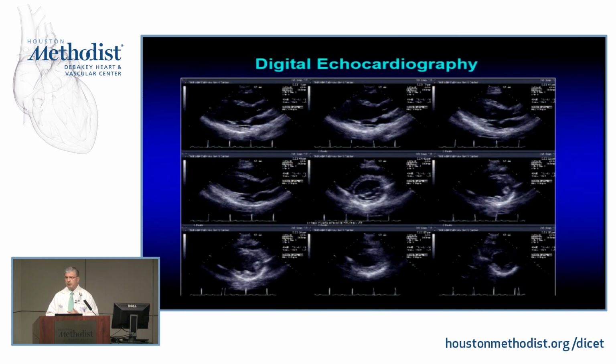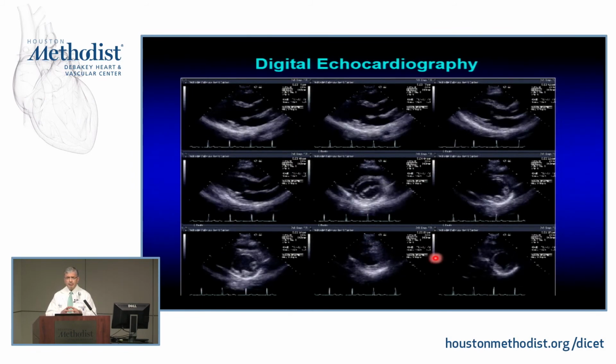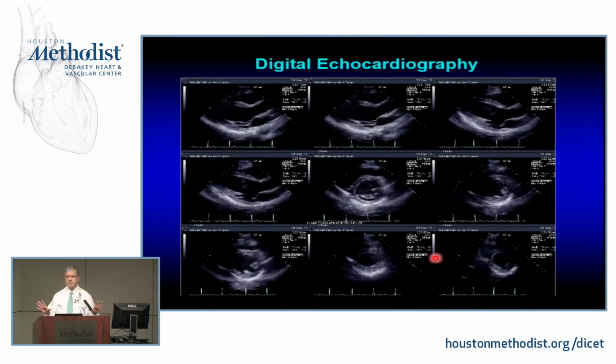Digital storage. We talk about it now, but there was a big invention first. It's very important because now with digital technology, it's not only about retrieval, it's how you interpret a study.